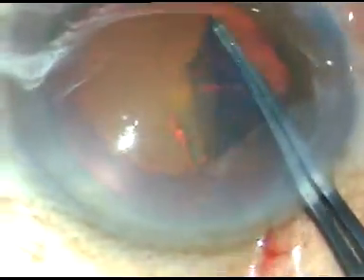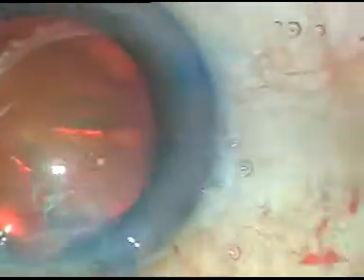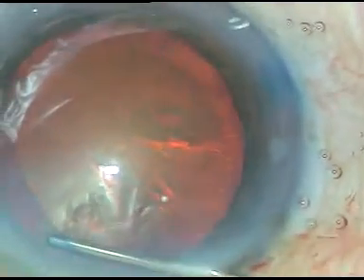So, in this way, by a smart pull, we can retrieve the rhexis which tends to go underneath the iris. Thank you very much for watching.